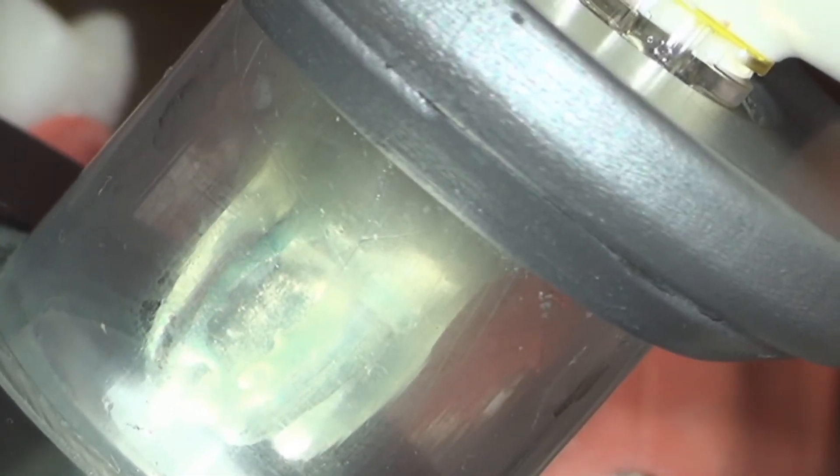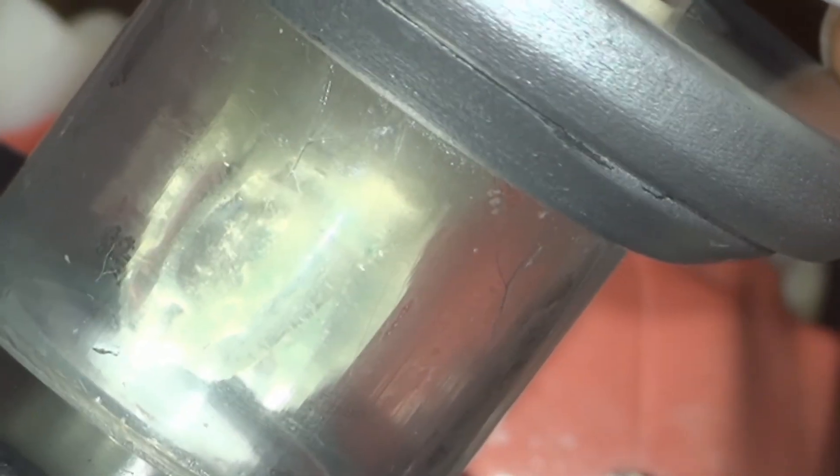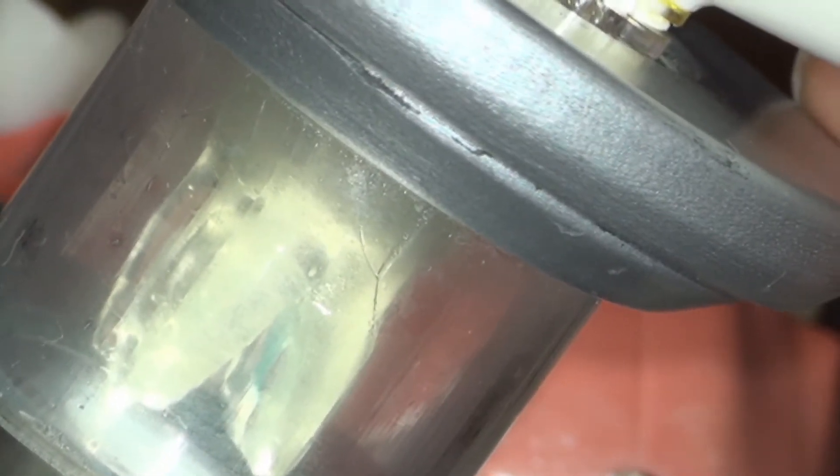Don't have any of the deteriorating properties of bleach or EDTA, but you can see it's pretty much gotten most of that material out. Maybe we could give it a little twist. You can have some other canals still full, looks like there's one on the back side that still has a little in it.